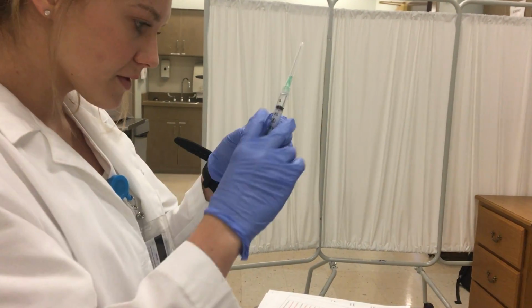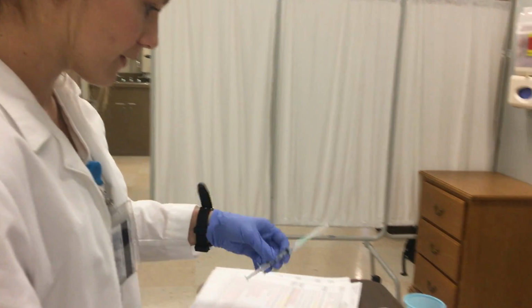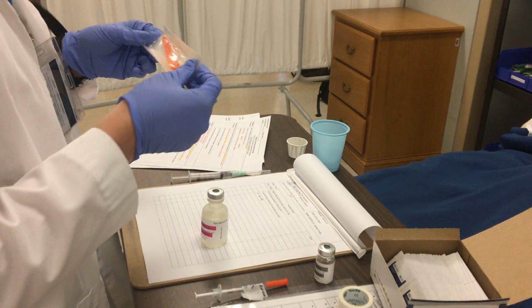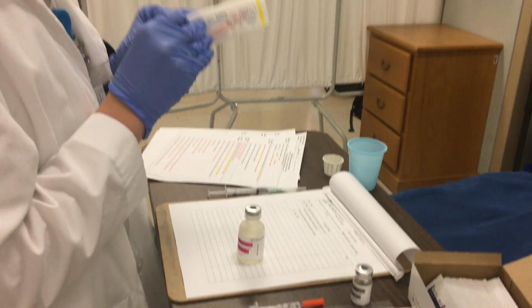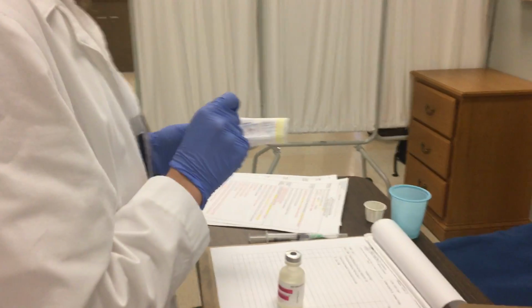Check for any air bubbles. Right. And I'm going to go ahead and change out this needle to avoid any dulling or pain to the patient.